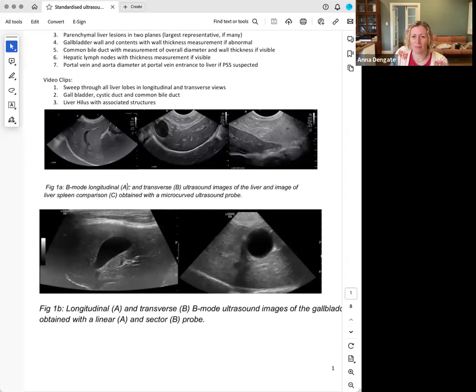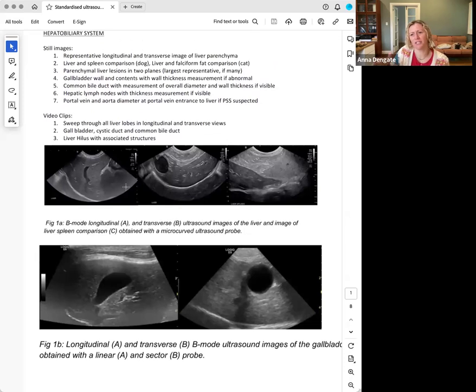And these are just examples, and there are conditional things. I don't want you to always dig for a portal to aortic ratio, but if a dog's really nicely sedated and you want to practice, go for it. But if there's any suspicion, I do want you to really prioritize it, and if you can't do it with the level of sedation, explain to the team managing the patient, look, there's something I really want to assess which would help me put shunt on or off the list. I'm going to need more sedation to do it. And usually they're pretty amenable if you explain why.